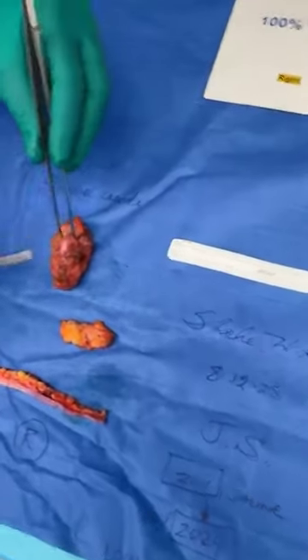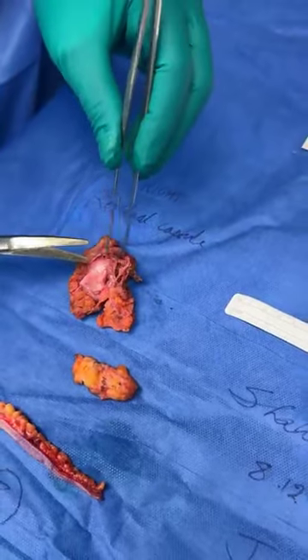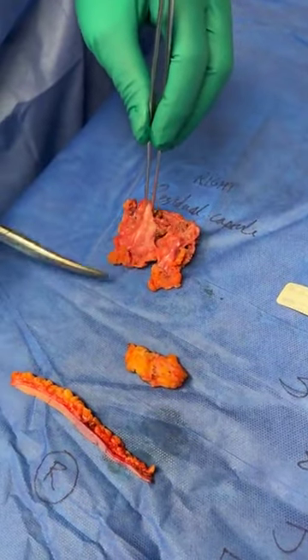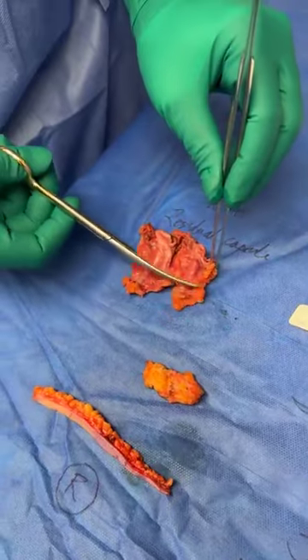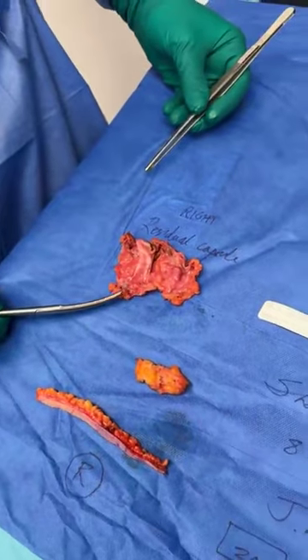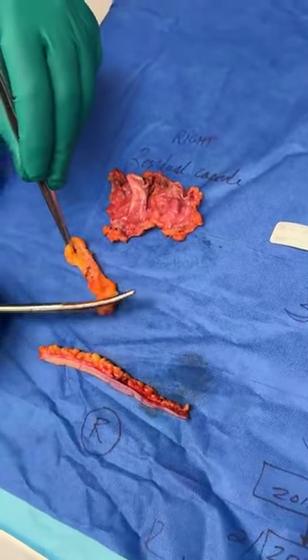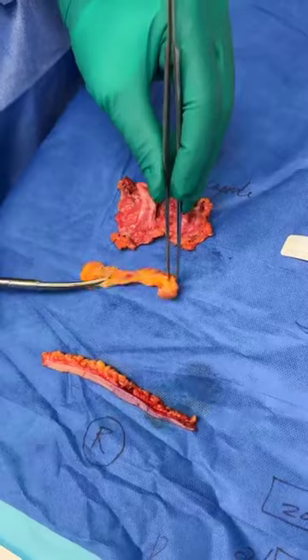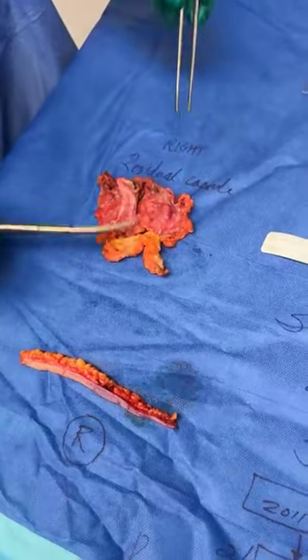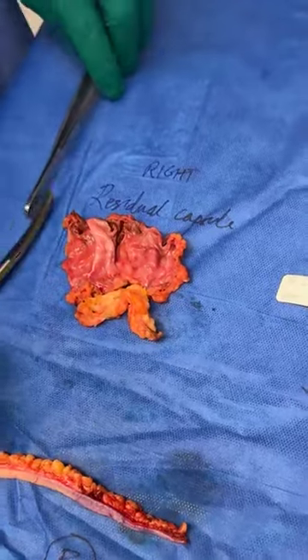And as I cut this open, you will see that glistening white appearance. It was relatively very tough. This was a lower BMI patient, and clearly, as you will see, this is inflamed tissue that is indeed very much present. And so the entirety of the implant capsule, all of that inflamed tissue, was completely removed. I removed some of the tissue at the bottom, and as you can see, this is where it looks abnormal. It is scar tissue, it's pathologic, and I'm going to send it along with the capsule such that the pathologist can roll out the BIALCL CD30 analysis.